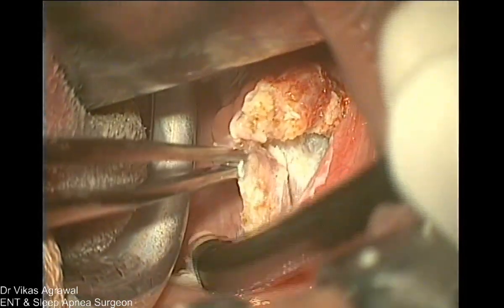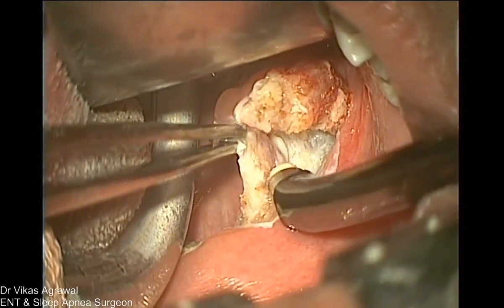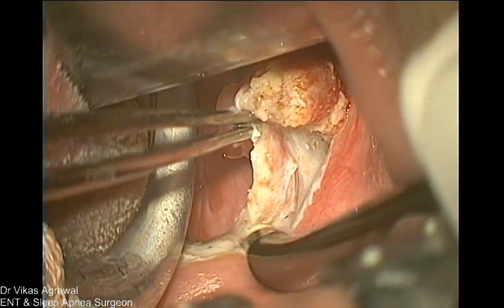So when you lift it like this, can you see this? Yeah. So you have to cut it here. Right. If you cut it here, it will not serve any purpose, because this is the bottleneck area. Right. So you have to cut it here.